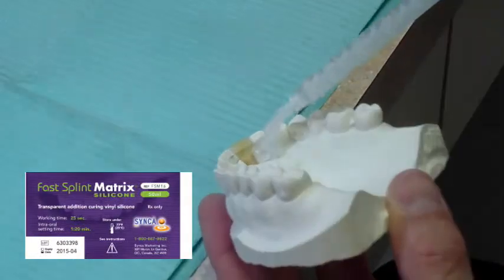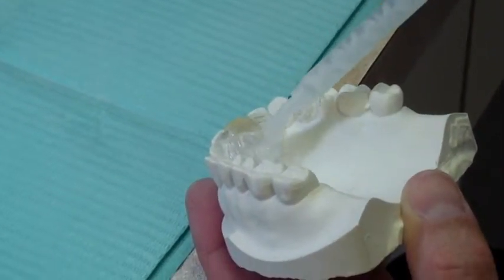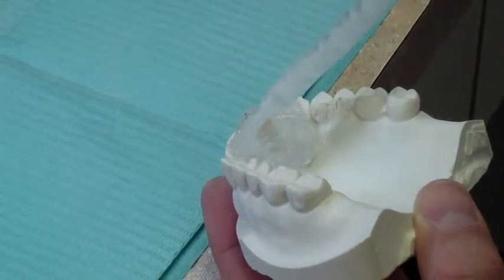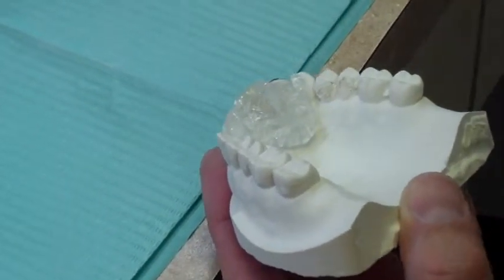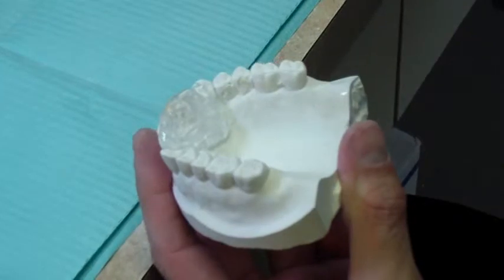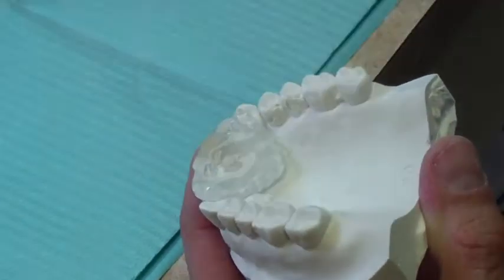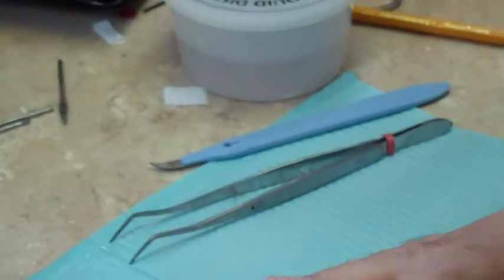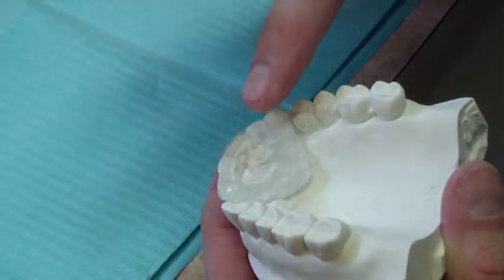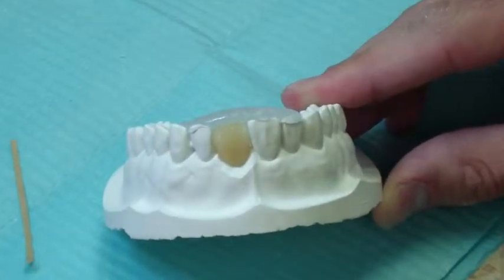Inject Fast Splint Matrix clear silicone over the area of the space maintainer in order to create an index or record to be used for the precise placement and positioning of the fibers. The silicone should be compressed to obtain a precise adaptation of the silicone to the model. You can use your finger to do so, ensuring that a separating media like isopropyl alcohol is used to keep your finger from sticking to the silicone. Ensure that the silicone covers the incisal edge of the teeth.